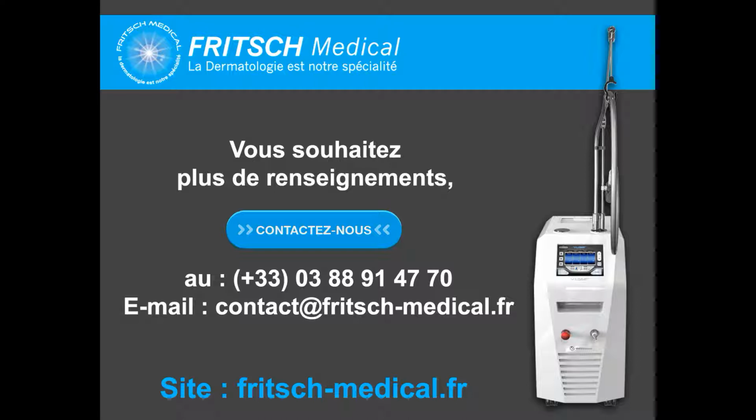For the skin rejuvenation, it depends what we are talking about, because for me, skin rejuvenation is normally only the KTP under the 532. When we described the efficiency of the vascular laser 20 years ago, it was for redness and superficial dark spots. So skin rejuvenation is very superficial for me.